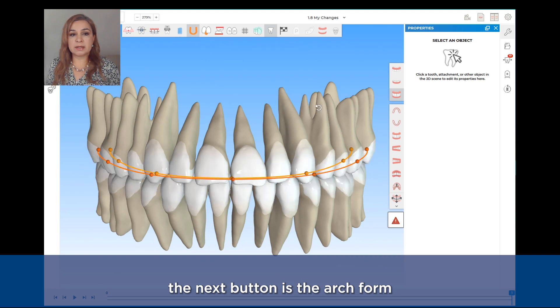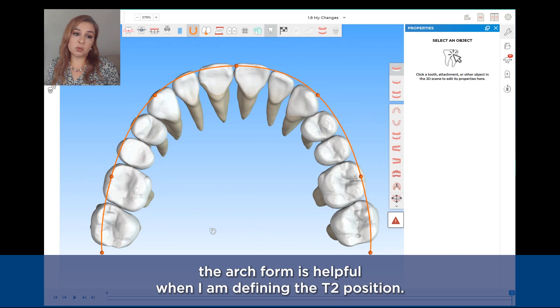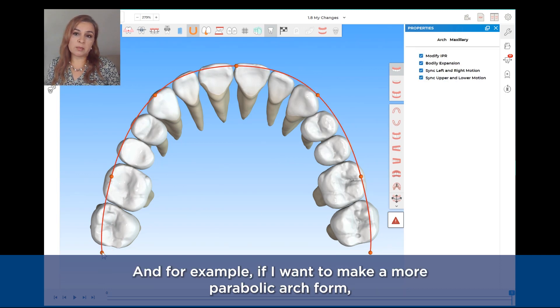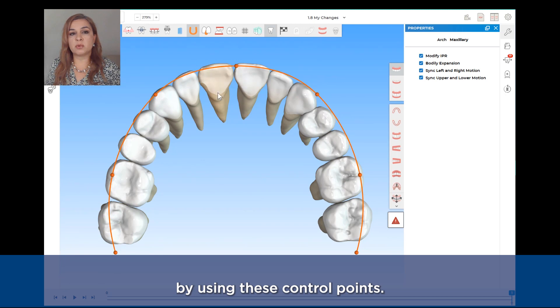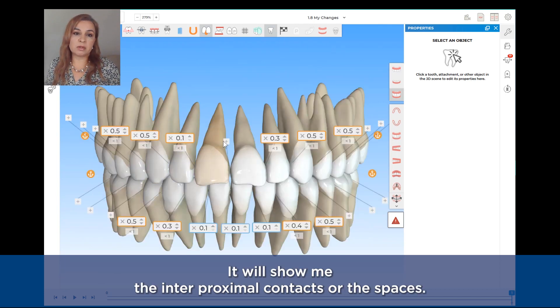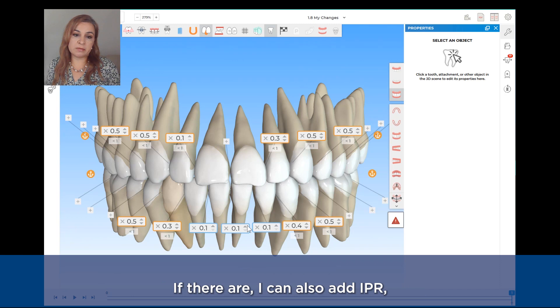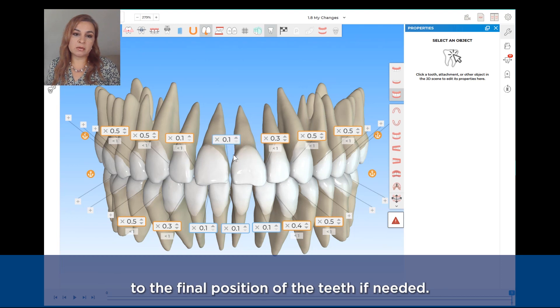The next button is the arch form. This arch form is helpful when I am defining the teeth positions — for example, if I want to make a more parabolic arch form, I can edit the position of the teeth by using these control points. The next tool is the IPR tool. It will show me the interproximal contacts or the spaces if there are any. I can also add IPR, remove it by clicking on the X, or add spacing to the final position of the teeth if needed.